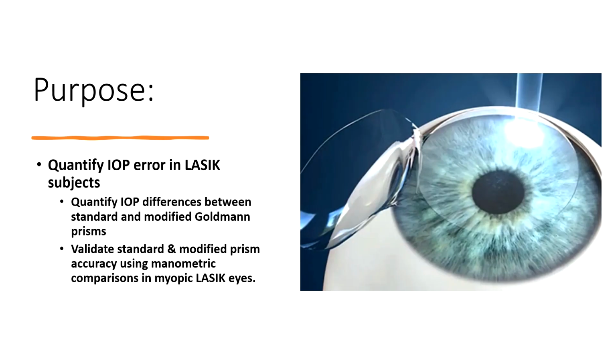The purpose of the study was to quantify Goldmann IOP error relative to intracameral pressure in LASIK subjects. Also, to quantify clinical differences between standard and modified Goldmann prism intraocular pressure measurements in LASIK subjects. And finally, to validate the modified prism's accuracy using manometric comparisons in these myopic LASIK eyes.